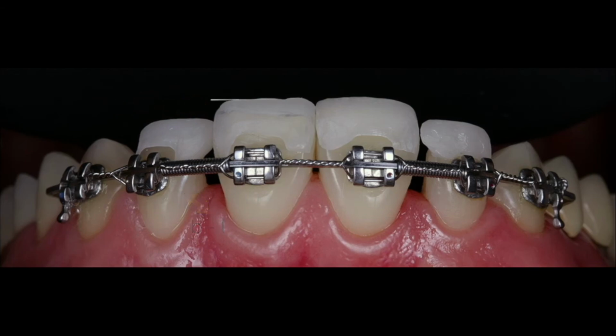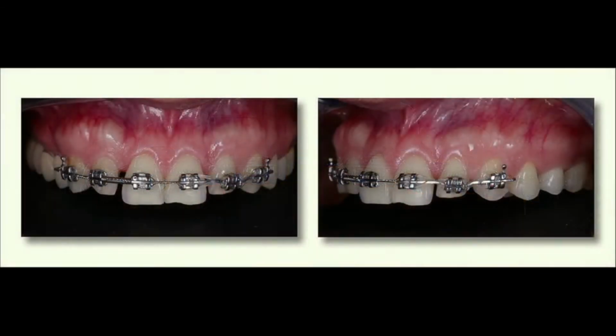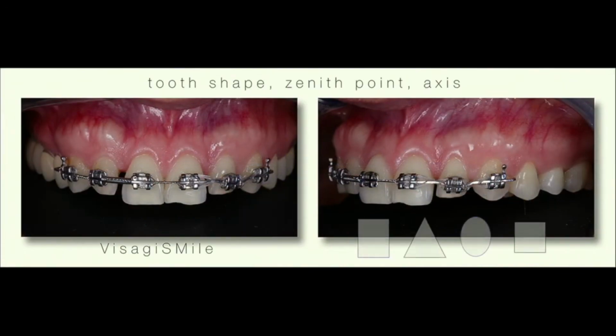And it also tells me about the incisal edge position versus the original tooth length, which will give me the thickness of the veneer. And to be supportive, I need to decide whether to move the tooth vertically up or down.